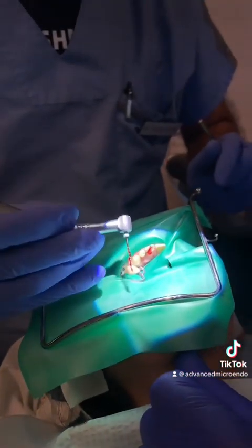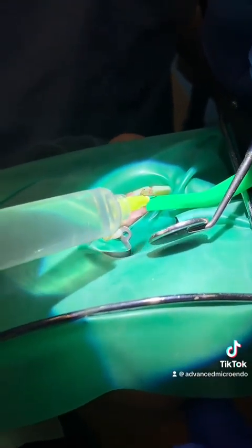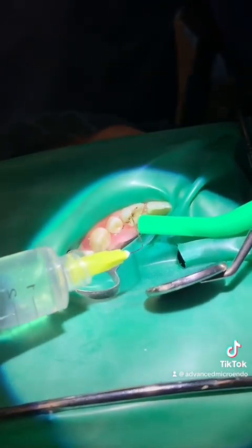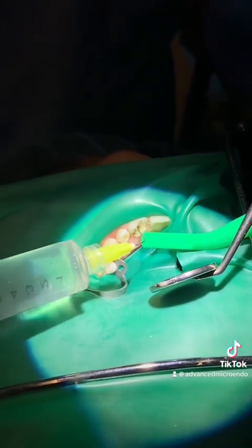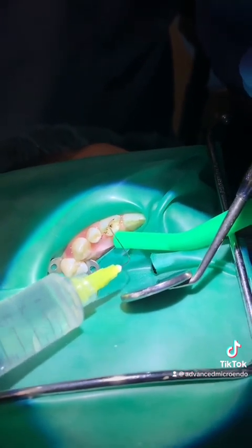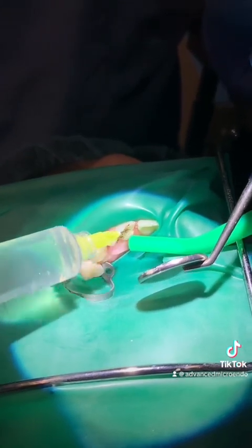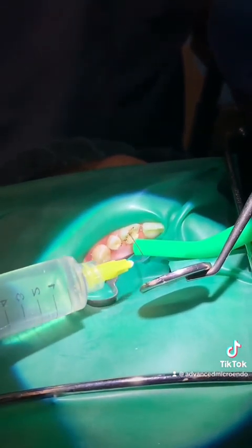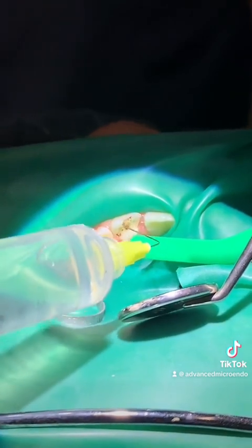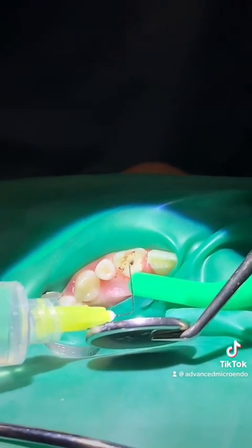What is that? That's the nerve. Looks like a snake. So the apical diameter of this tooth is very large, but I'm not afraid to use hypo. This is 6% hypo, and I'm not afraid to use it. You know why? Because I know how to use it properly. I'm a chef who knows how to use his sharp knife properly. So same thing with this. Full strength hypo. I'm not afraid to use it just because this tooth has an open apex. I'm still going to use it.